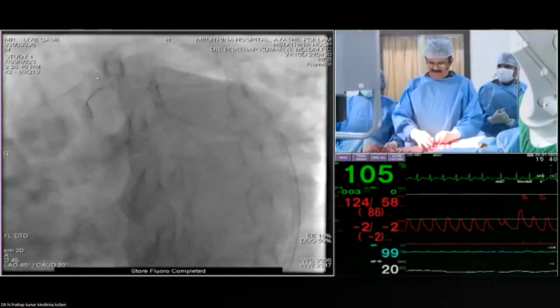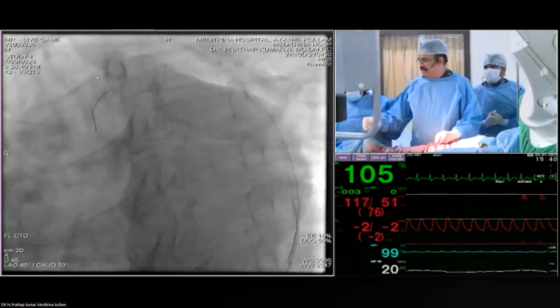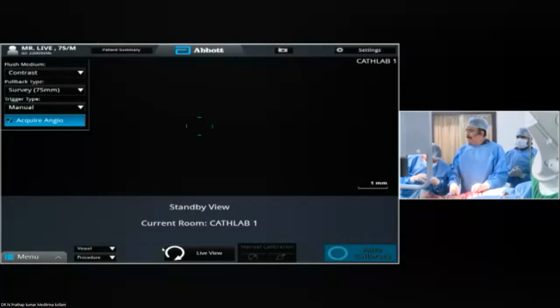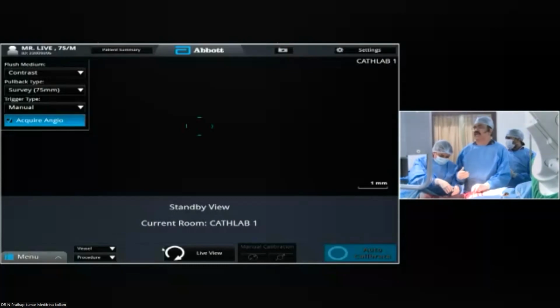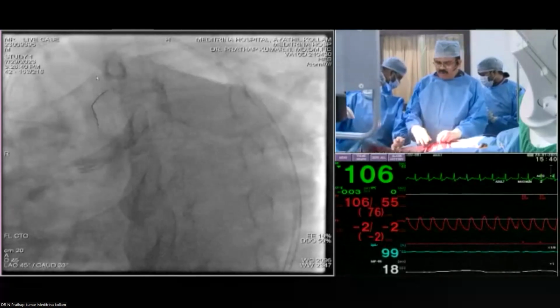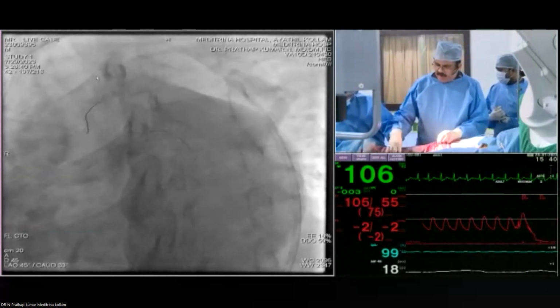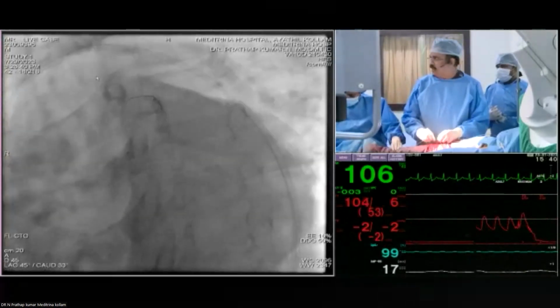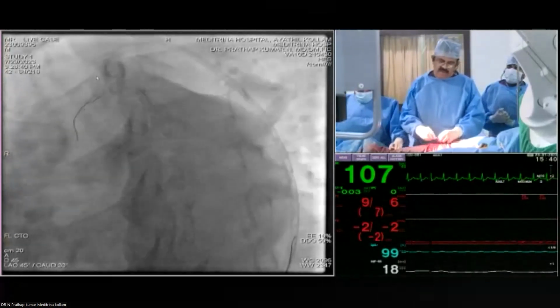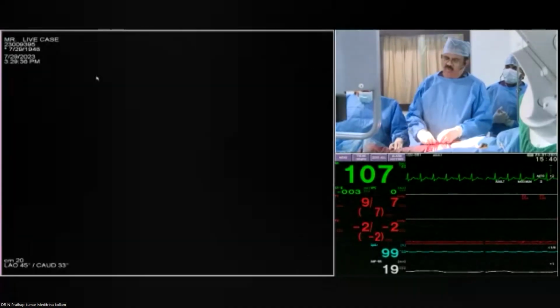Excellent. Now we will go with the OCT first, see the OCT run, then kiss and then come out, because if there is no time, I will not be able to show the OCT. Yes, we want to see the OCT. I did not do one thing which we usually do: a fluoro clear stent, to understand that the stent has ostial covering with the two layers.